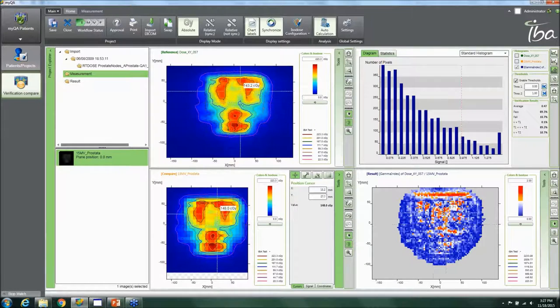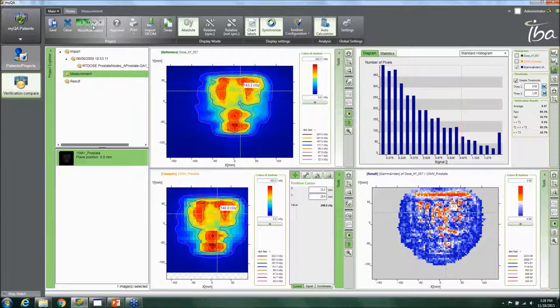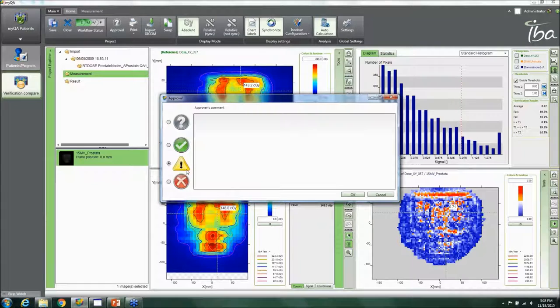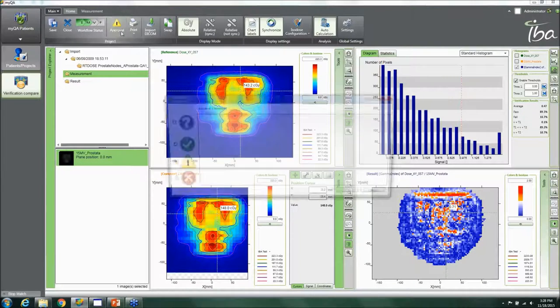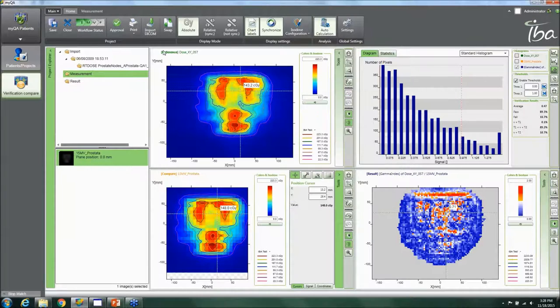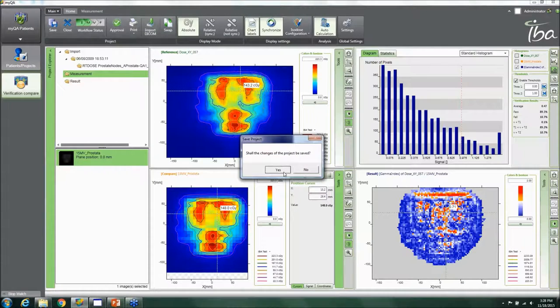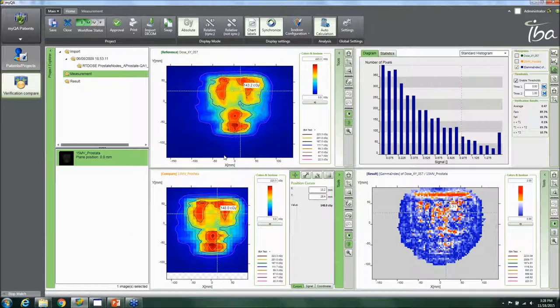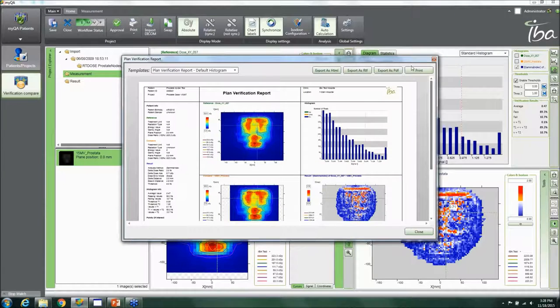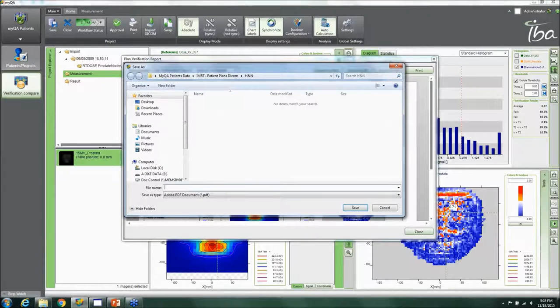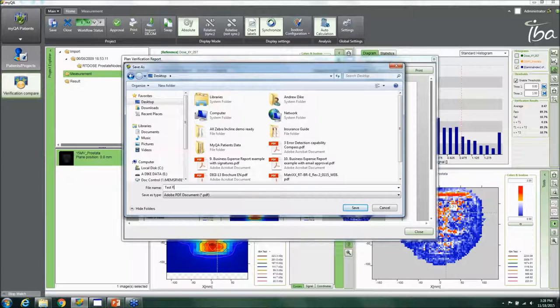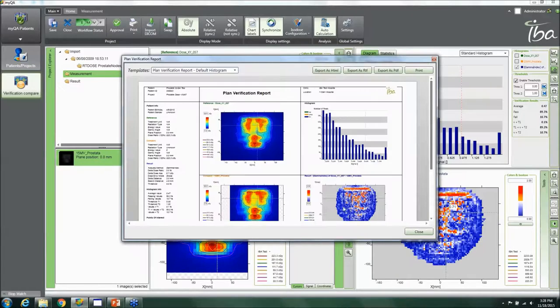The same cursor and dose-point functionality is available for VMAT as for IMRT. If you want to send the plan to your chief physicist for review, you can flag it. To generate documentation, you click to print a quick verification report, click Default, confirm saving, and a report is created for each field. You can export it as a PDF — for example, saving it to your desktop as a test report.